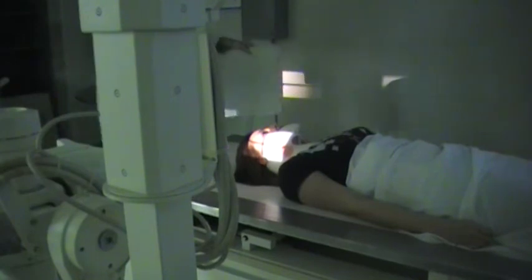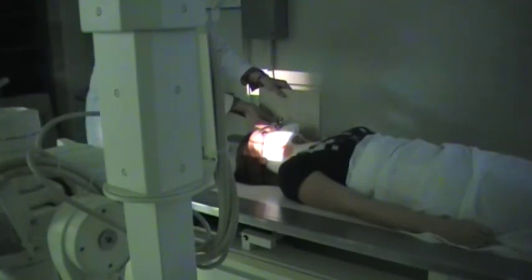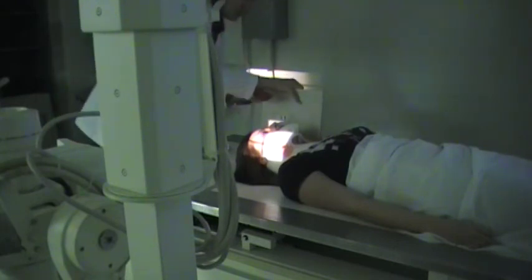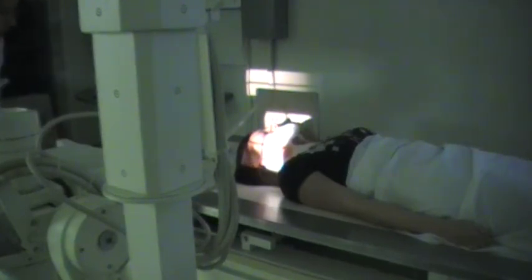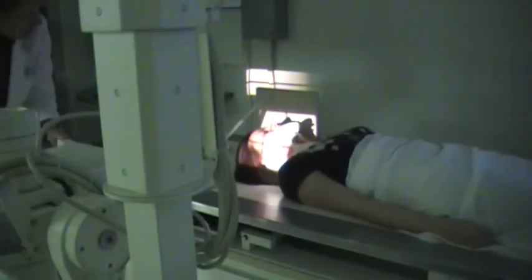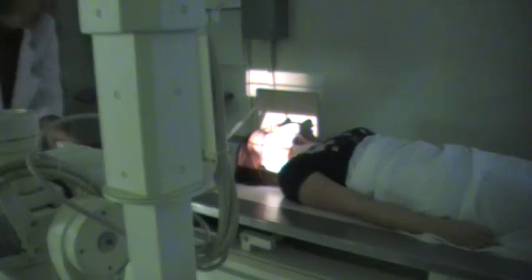Okay, I'm going to be propping this cassette to her left side. And since this is the left side of her face, I'm going to put the left marker here. And I'm going to go ahead and tape the cassette in place so it does remain upright. It's usually a good idea to use a grid cassette. I think you get a cleaner picture that way because you are using a little bit more technique. And you can get a decent image using a regular non-grid.